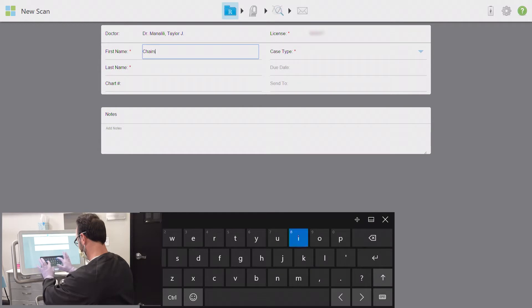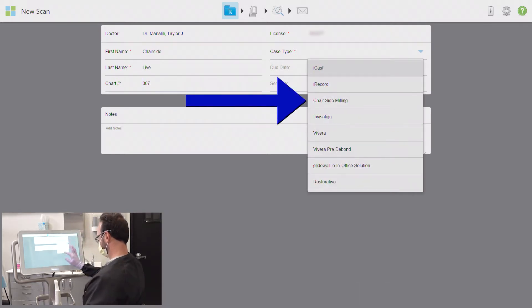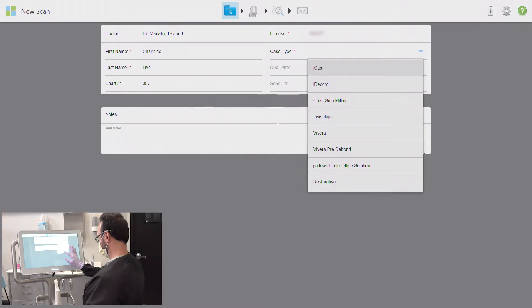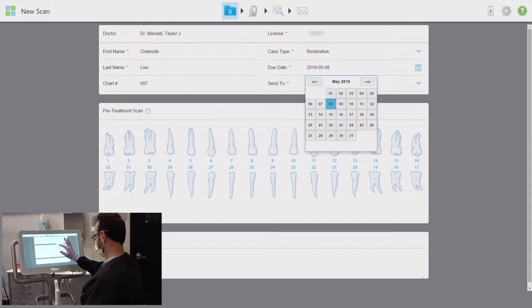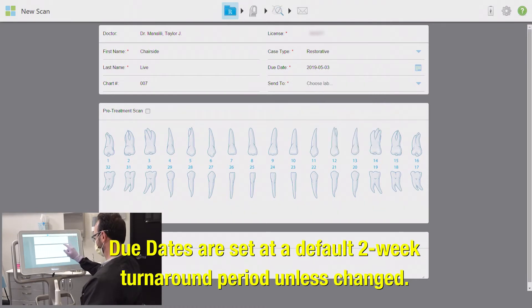I'm just going to enter this patient's information quickly — I'll usually do this before my doctor actually prepares a patient so it's all ready to go when they are. If you are sending this case to your own chairside mill, select the chairside milling or glidewell.io in-office solution option under the case type menu. The due date for a chairside mill doesn't really apply but it has to be entered; the menu won't allow you to select today's date even if you are milling right now, so I simply select the next day or any day.